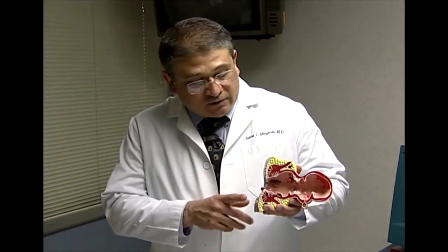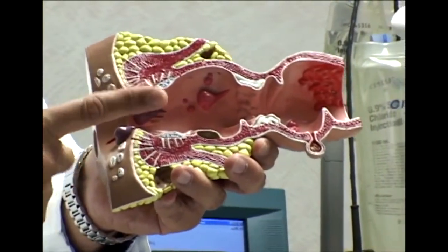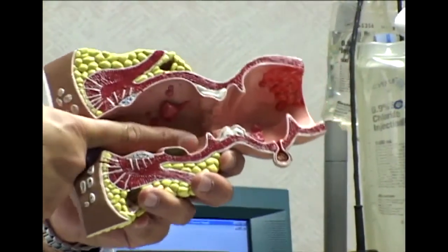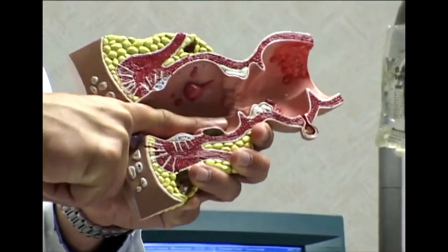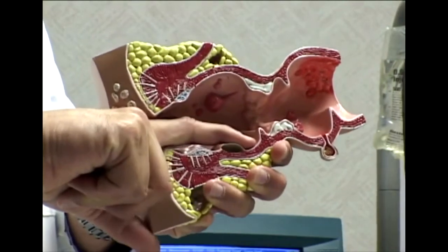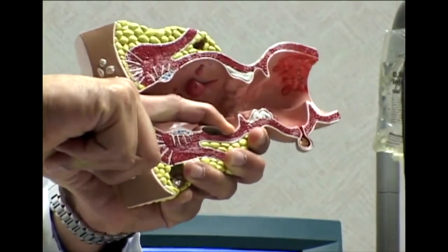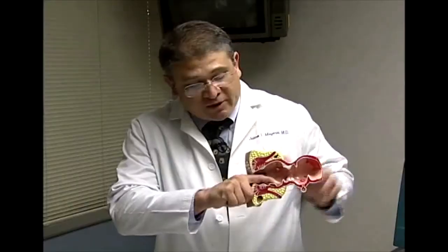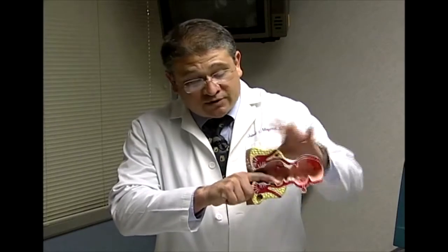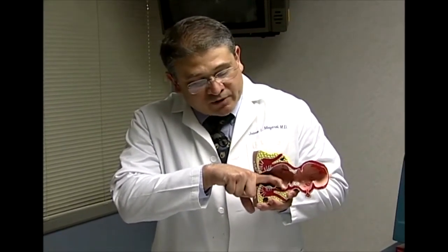I take my index finger after placing the St. Mark's stimulator on it, and first do the rectal exam, placing it posteriorly, touching the coccyx, and then rotating it approximately 90 degrees over the levators, and then hooking it so that I can get the pudendal nerve. The key to this test is making sure your index finger is placed as far as it can go. That way you'll be sure to identify the pudendal nerve.